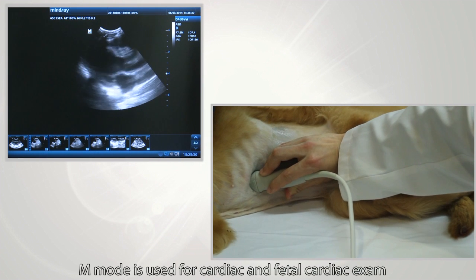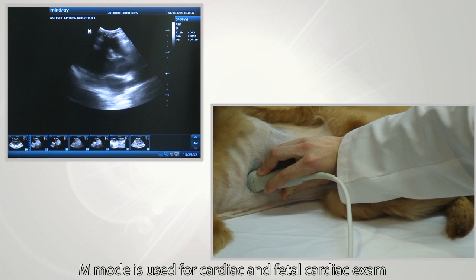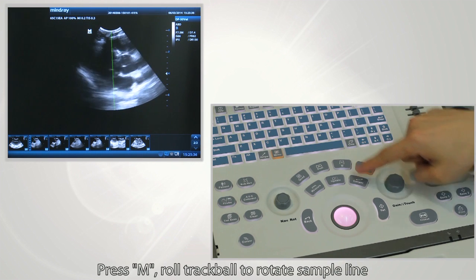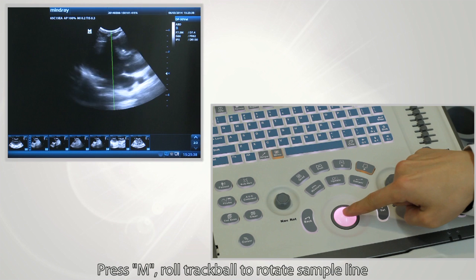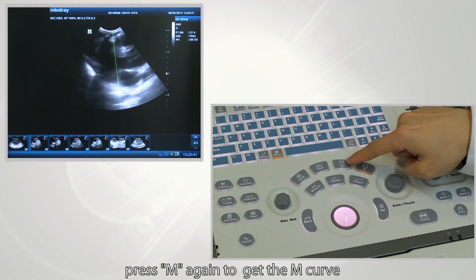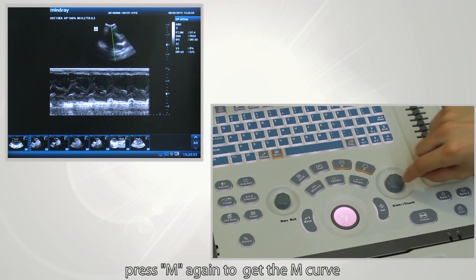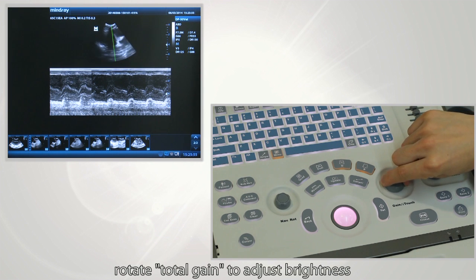M-mode is used for cardiac and fetal cardiac exams. Press the M button and roll the trackball to position the sample line. Press M again to get the M curve. Rotate the total gain to adjust brightness.